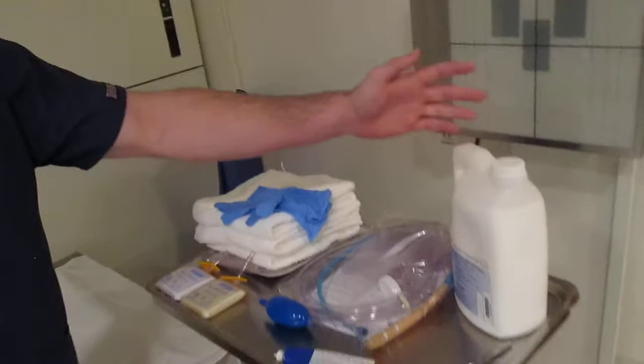Alright, today we are doing my barium enema and these are my supplies. If you come over here we have our barium solution — it's 105%.